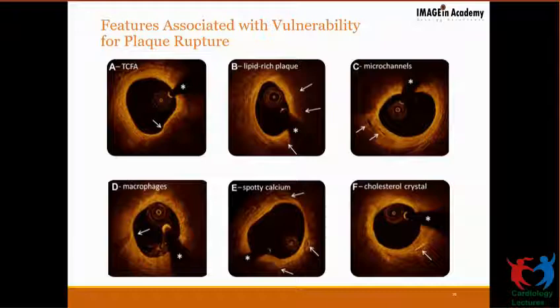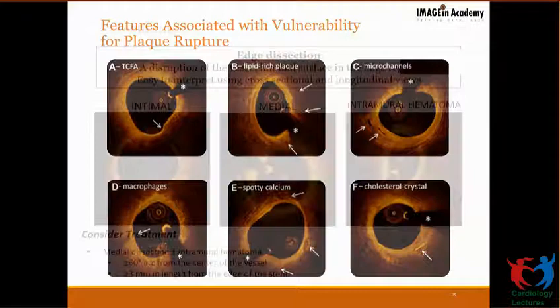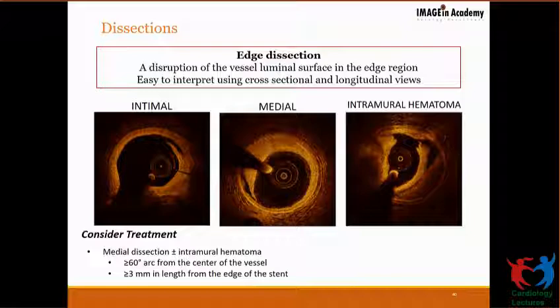So it's a complete spectrum, and 1.5 hours is too little time for this, but I'm just sensitizing you. You can also pick up cholesterol crystals, which are very bright pixel images on your frame. If the vessel wall is damaged, you can get edge dissections, which could be intimal or extend onto the media. And if it goes beyond that, you can have intramural hematoma, images of all three on your screen.